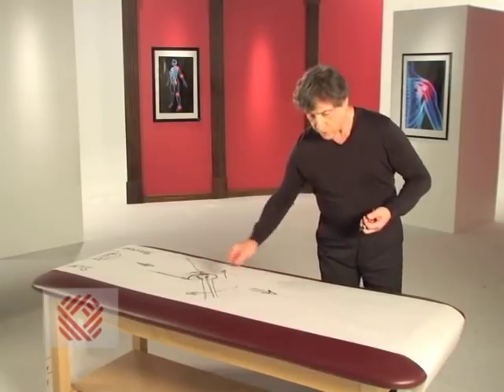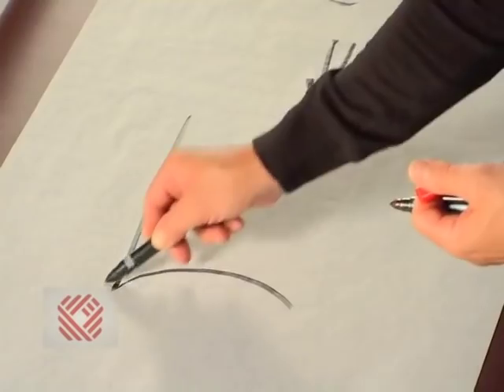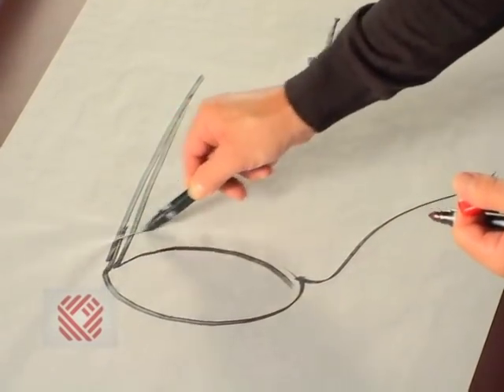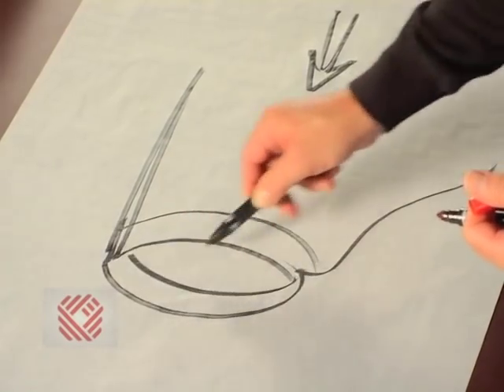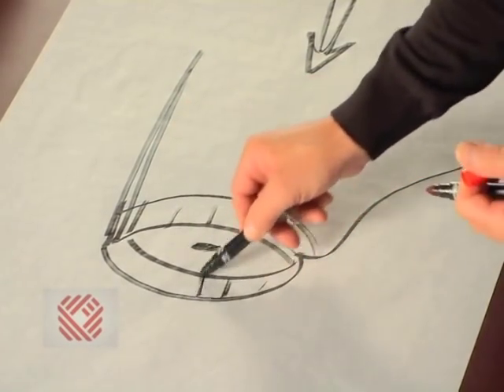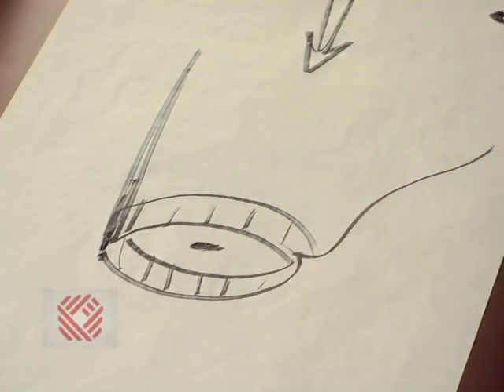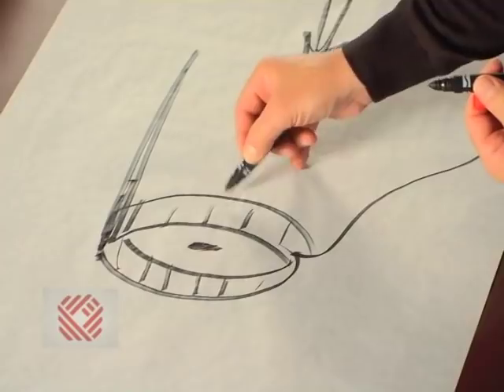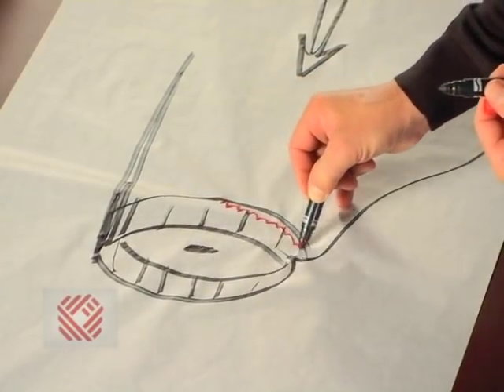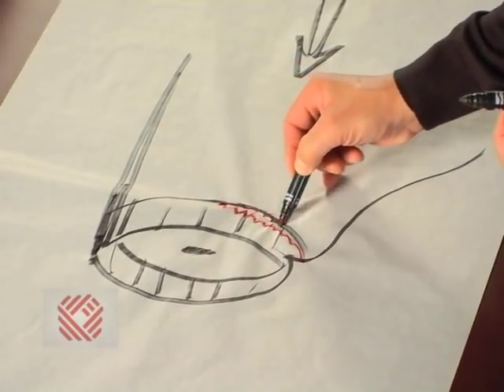Let's look at that torn labrum. We have the bony socket, the shoulder blade, the labrum, and the middle of the socket. The labrum in three dimensions — and the tear is down here, right where the labrum is pulled off the bone.